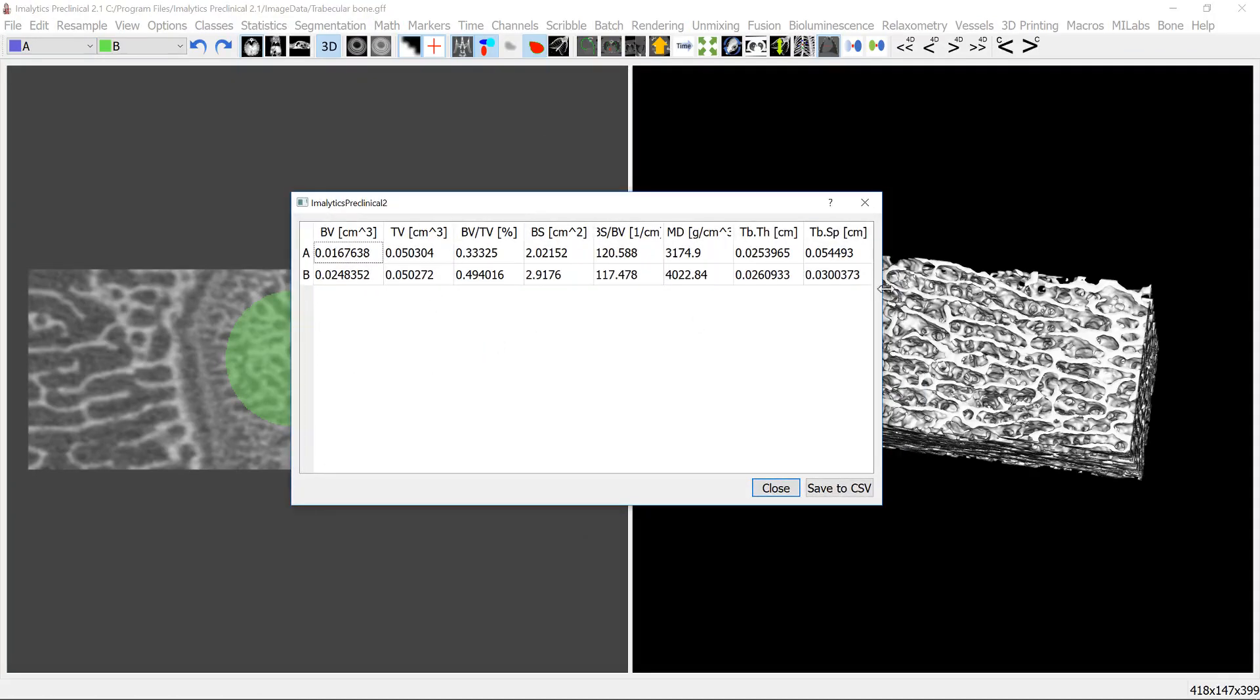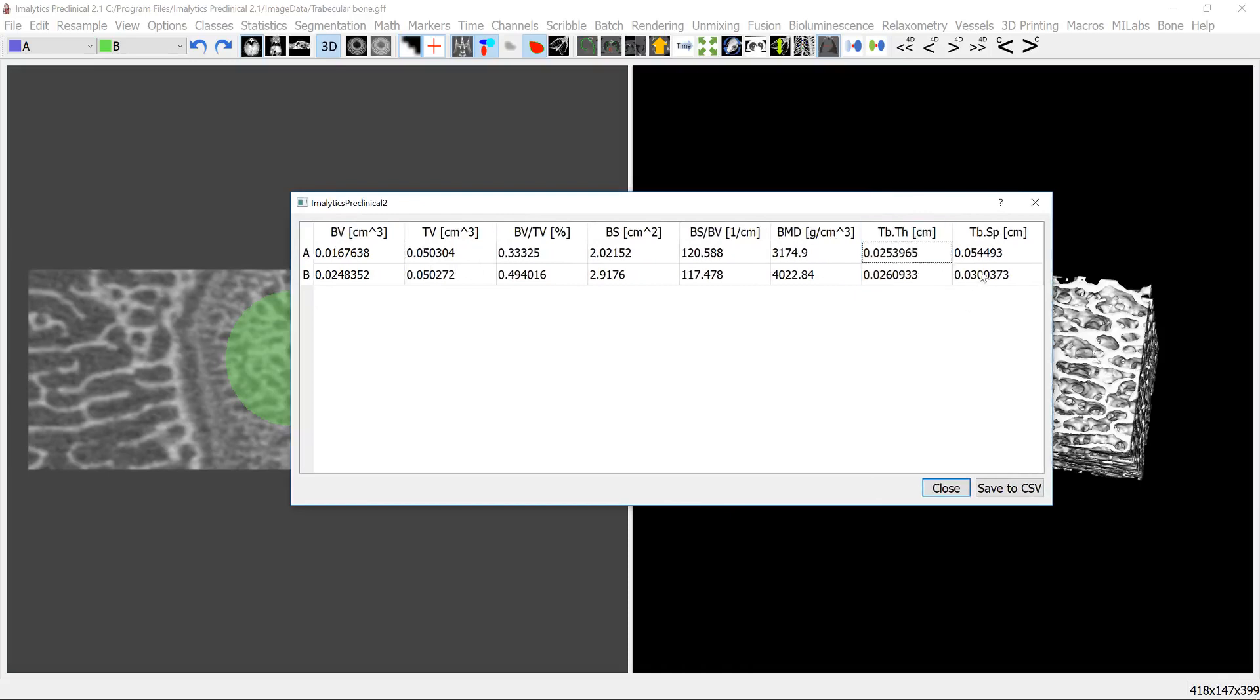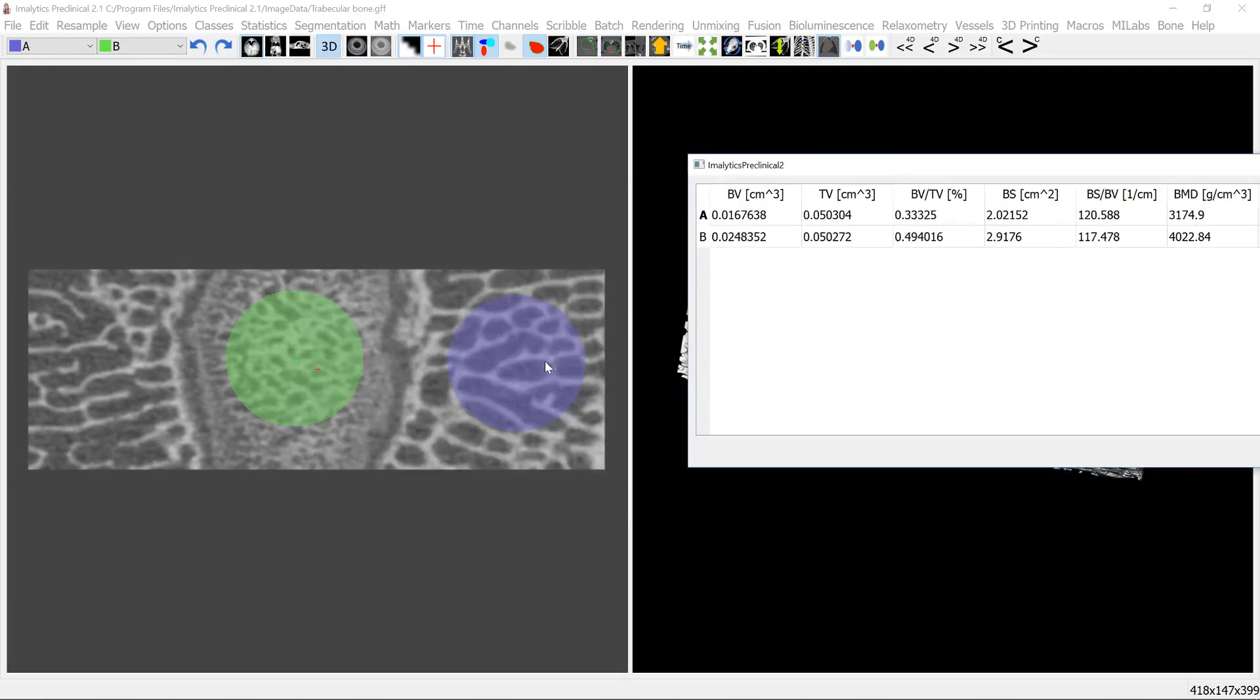And the thickness is actually quite similar for these two regions, but the spacing here is thicker for A than for B. As you can see here the spacing is thicker here than here.